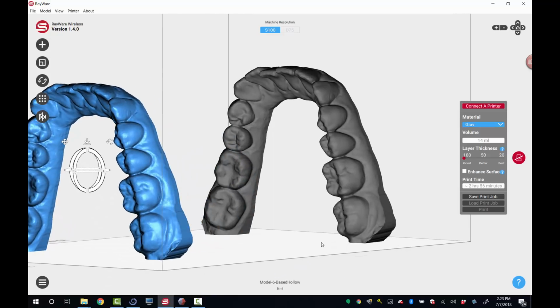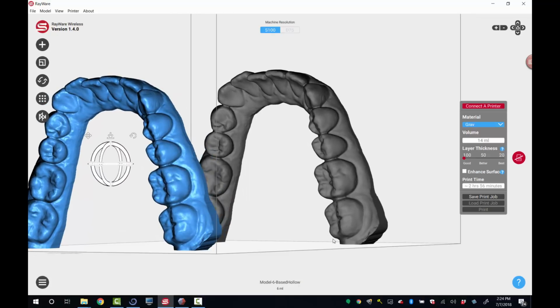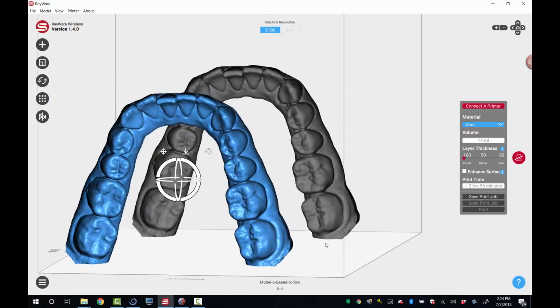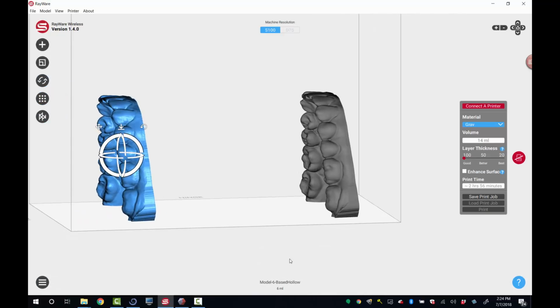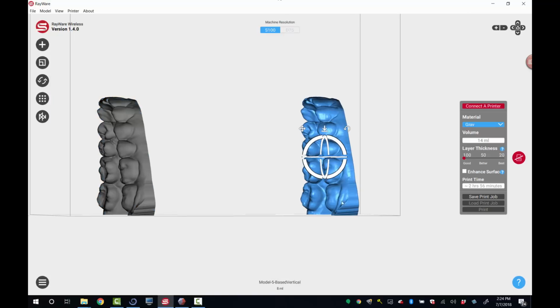If you're using the Form 2, that's approximately 3 millimeters. So for the first 3 millimeters, you run the risk of this area being slightly inflated. That may not matter, but I want you to know that, because if you're printing certain things where the data right next to the print platform is important, you want to know that it's not going to be dimensionally accurate. That's where raising it up, having it on supports, having something that gets it away from the print platform is going to be important. When I said raising it up, I mean stacking it on a print platform, putting it on supports. You can't simply drag this upward because it has to be adhered to the print platform.